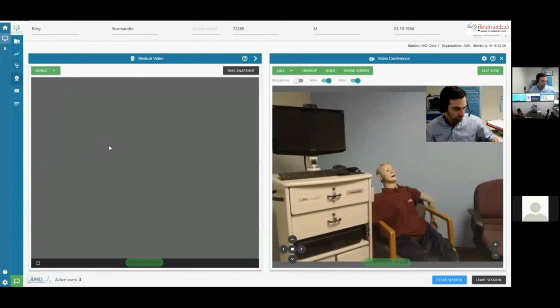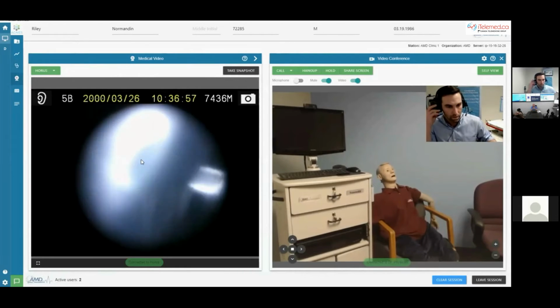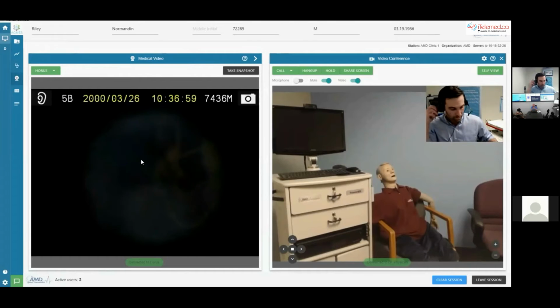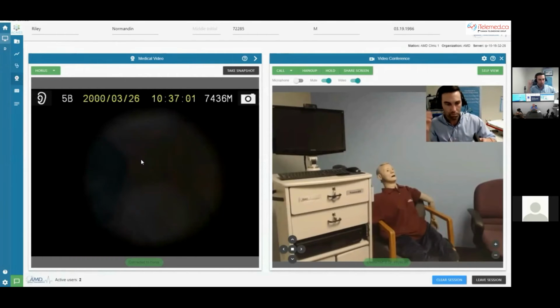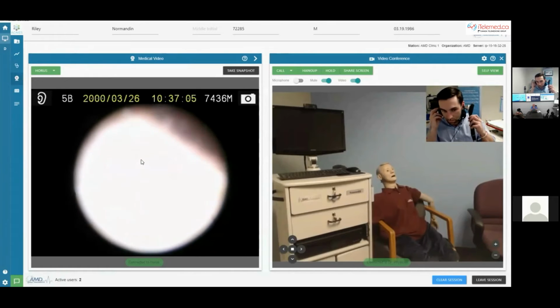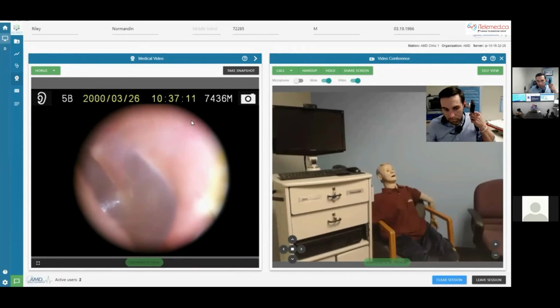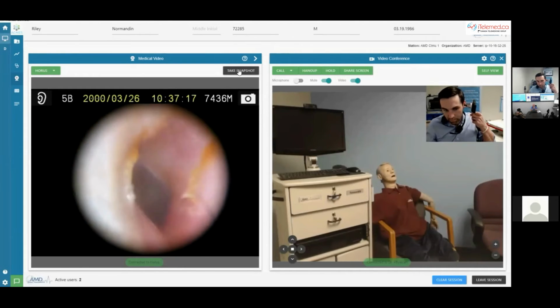So, for example, using my ear, I have this video otoscope. We can take a snapshot.